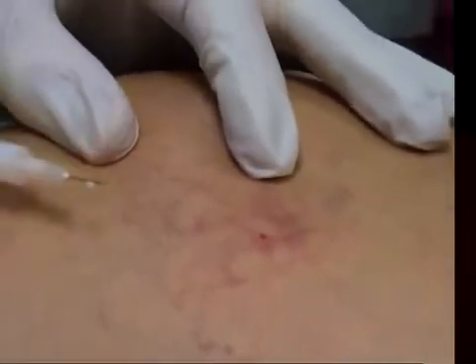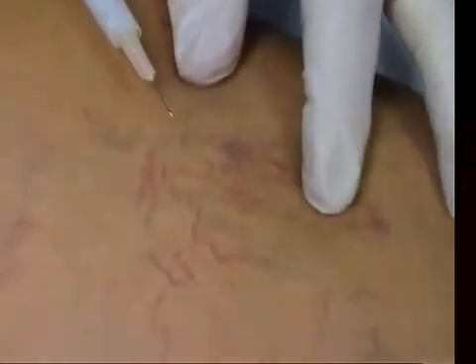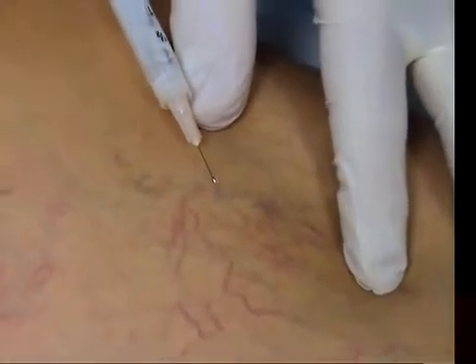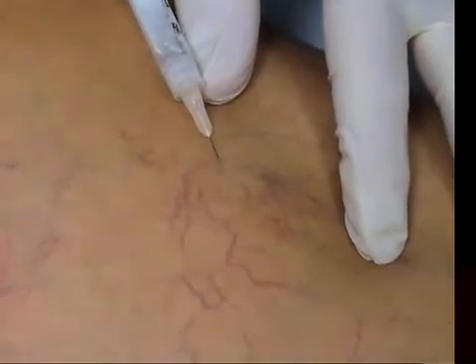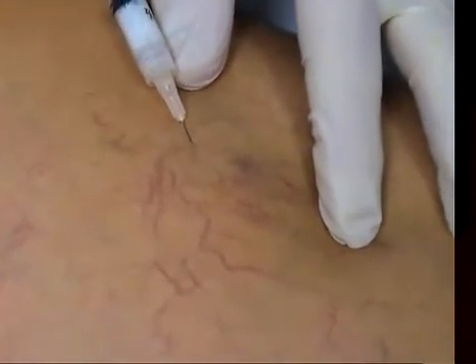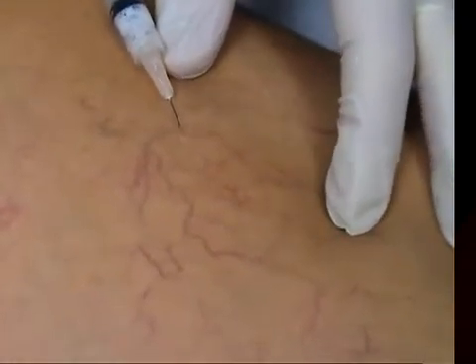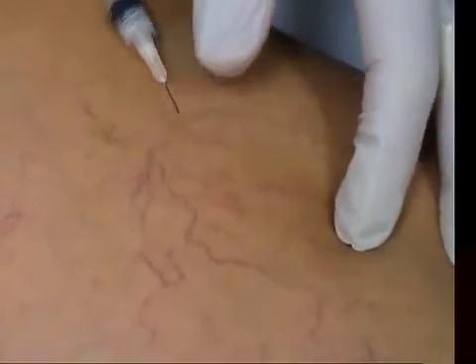I'll show you that in just a minute. Bevel up, slightly bent here. There are a number of locations we can go — we can go in here for instance. Skin on the stretch a little bit, needle in that vessel. I think you can see pretty clearly I'm injecting. Can you see that disappearing there? I'm always looking at the tip of the needle just to make sure there's no extravasation right at the tip.